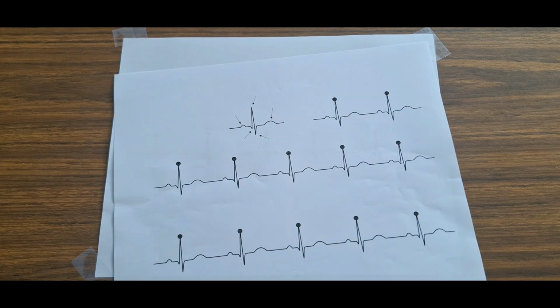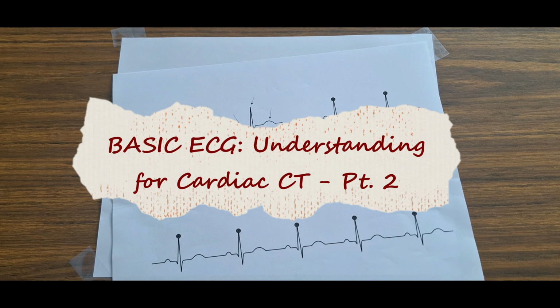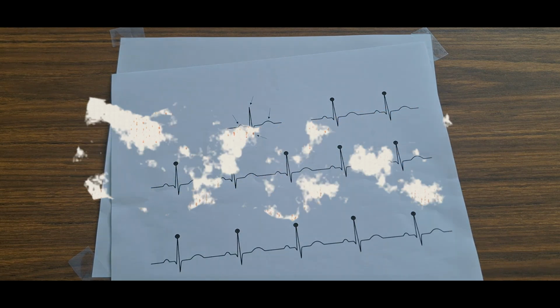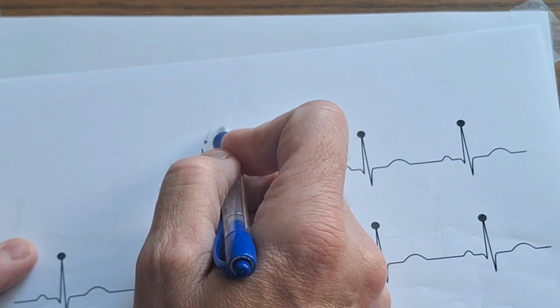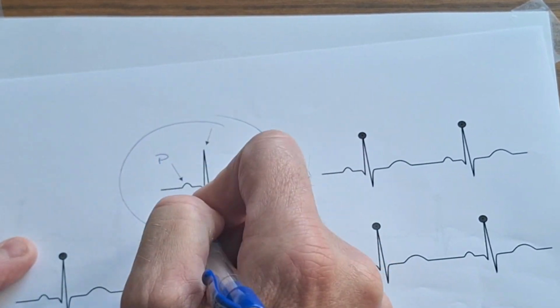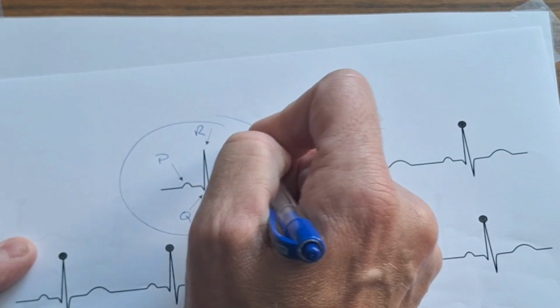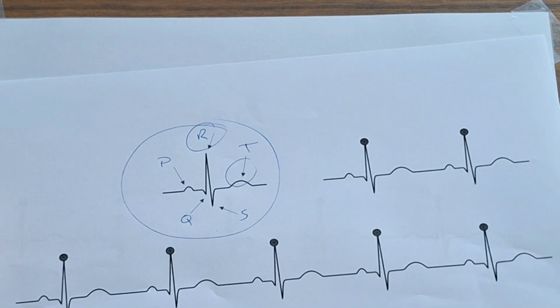Welcome back, guys, for part 2 of diving into the basics of ECG understanding for cardiac CT specifically. In the last video, we covered the rough idea of the PQRST wave. Again, P, Q, R, S, and T. R being the most important, T being the second most important.